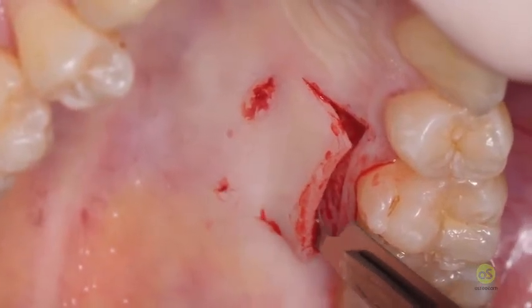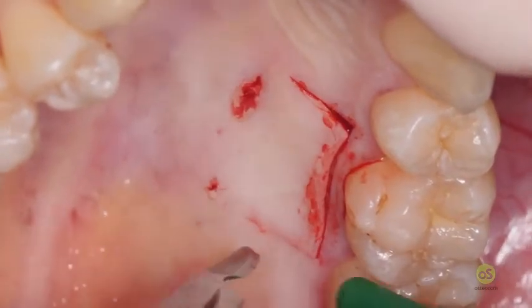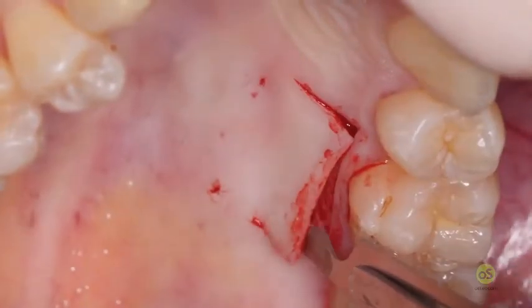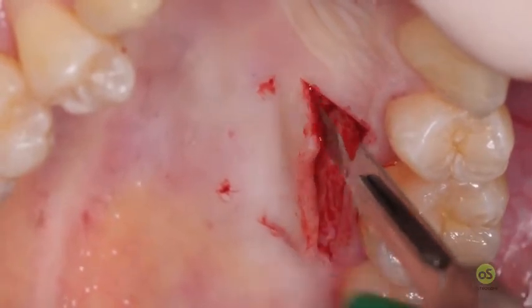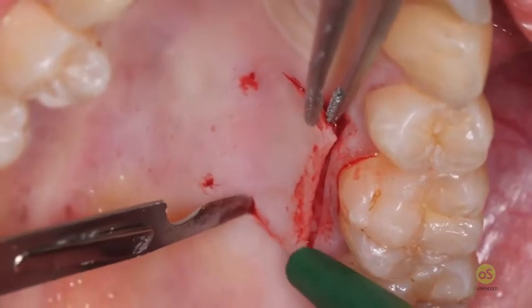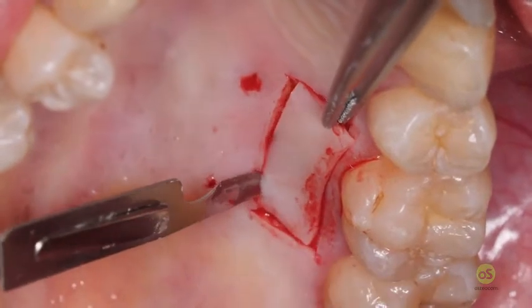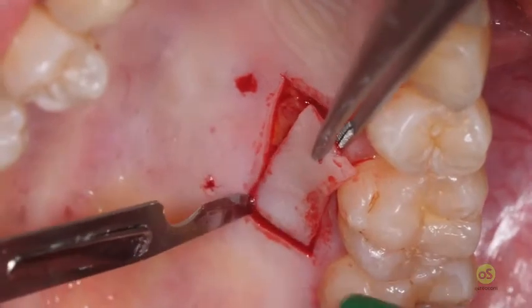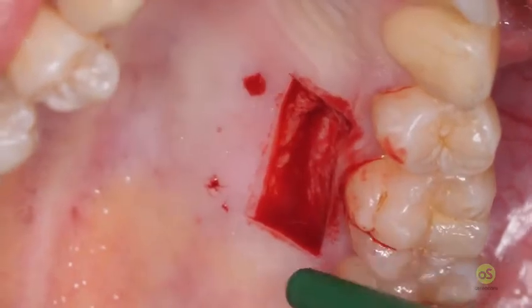Keeping the blade parallel to the soft tissue, increase a bit the depth of the vertical incision, also distal, so it's not bleeding at all during the harvesting procedure. Now everything is free. It's time to connect the most distal with the most mesial aspect. Make this incision deeper. Leave the fatty and glandular tissue as much as possible in the palate and remove the graft.